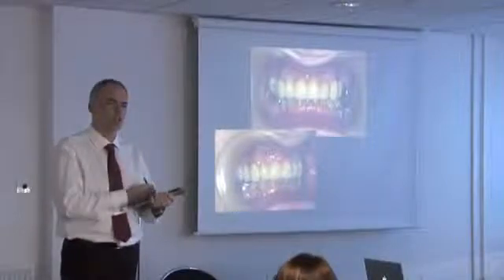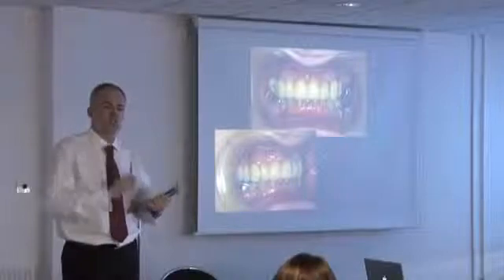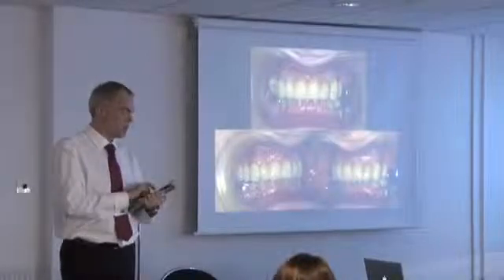Public out there don't think of that as a clasp. If they did, I can take a sandblast out. When you sandblast that, they don't see it. Because it doesn't shine out, it just looks like a filling. And there we go.